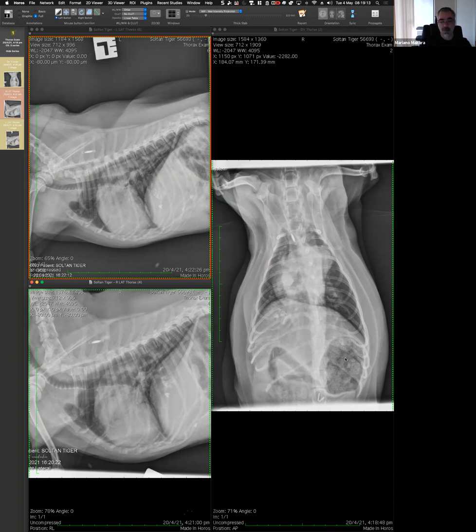So yeah, I agree. I was probably trying to warn that this works most of the time, but in some cases, what I was trying to say is that the severity of the clinical signs sometimes doesn't match the severity of the radiographic signs. I just want to make that point. Anyway, what else?